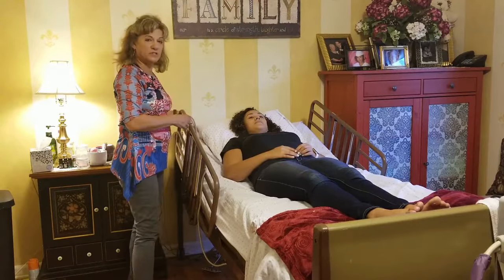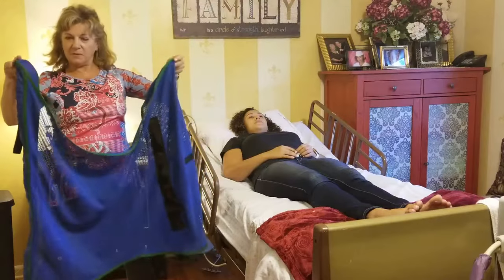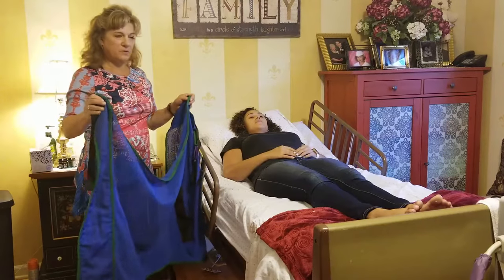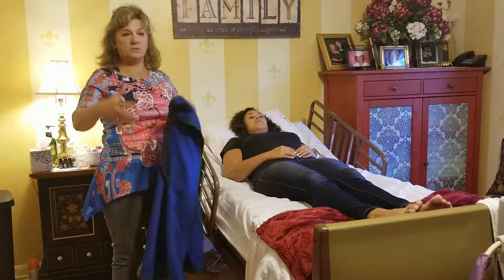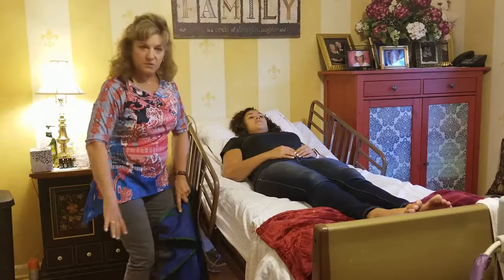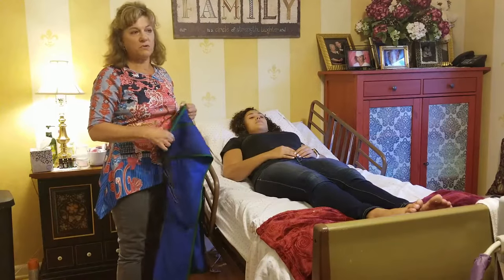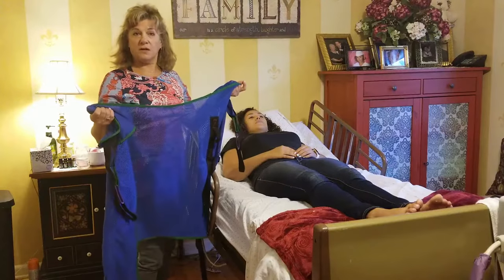Now I'm going to get the sling and show you what it looks like. Slings come in all different sizes depending on your weight. There's a top part, a bottom part, and straps. Some slings have a hole in them so you can center the hole under the person — without a diaper — and transport them right onto a commode. There's also another type that's a single strip that goes under the legs, also designed for commode use. When ordering a Hoyer lift, ask for a sling with a hole if you need commode access.